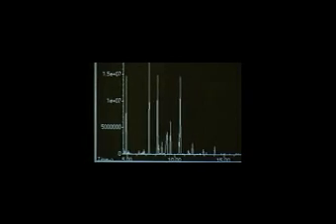However, organic acid analysis is more complex and requires a more sophisticated piece of equipment. Organic acid analysis involves solvent extraction and a modification process to enable the separation of a complex mixture of compounds by gas chromatography, and their subsequent identification by mass spectrometry.